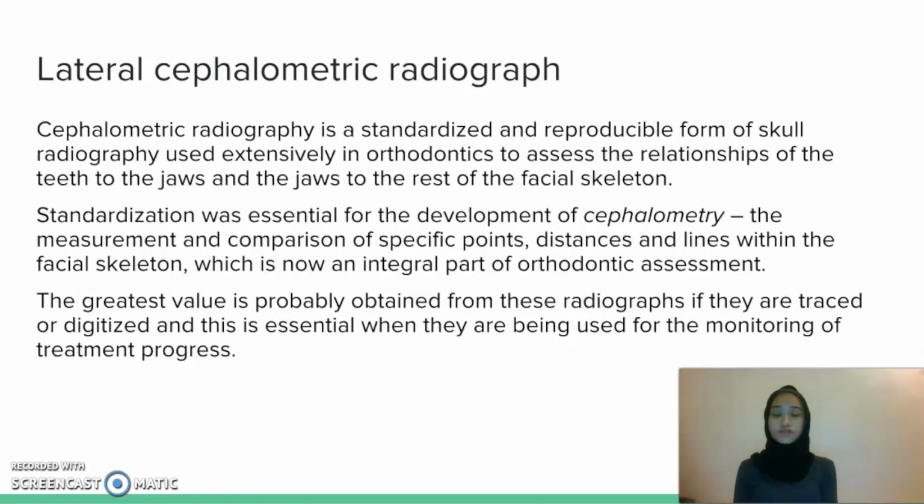Next is the lateral cephalometric radiograph. Cephalometric radiography is a standardized and reproducible form of skull radiography used extensively in orthodontics to assess the relationship of the teeth to the jaws and the jaws to the rest of the facial skeleton. Standardization was essential for the development of cephalometry.